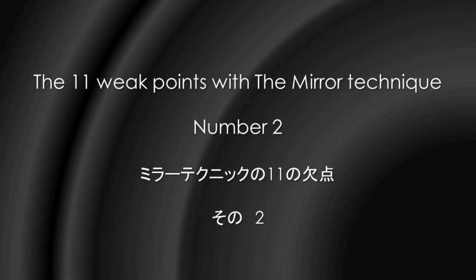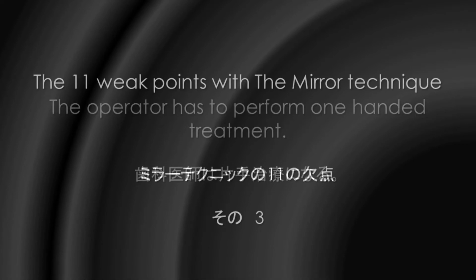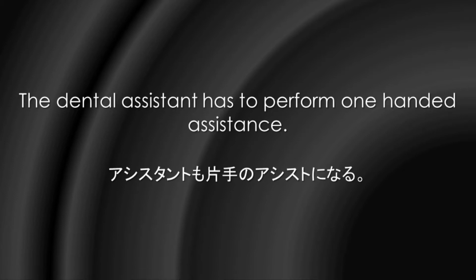The 11 weak points with the mirror technique. Number 2. The operator has to perform one-handed treatment. The 11 weak points with the mirror technique. Number 3. The dental assistant has to perform one-handed assistance.